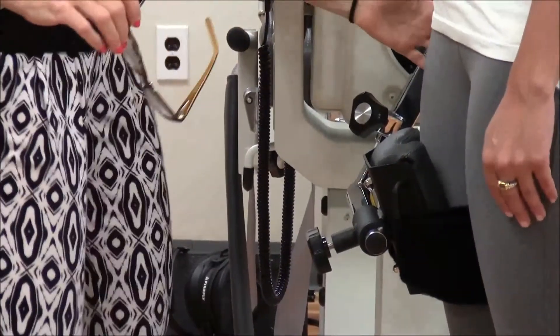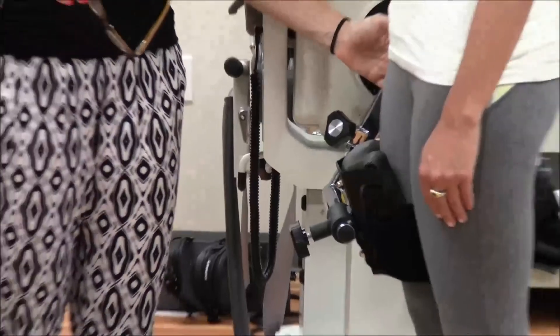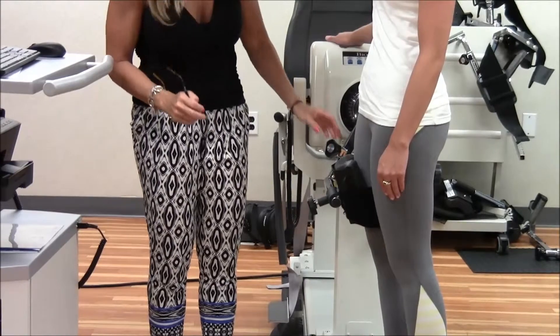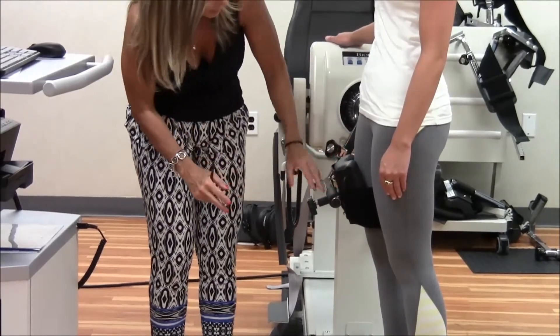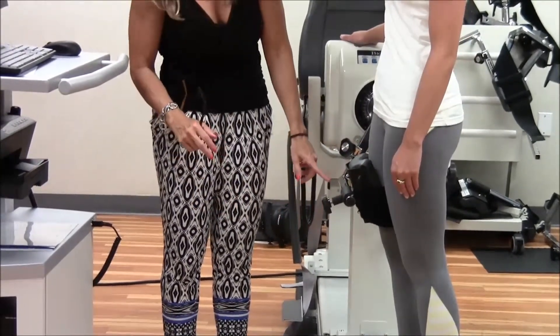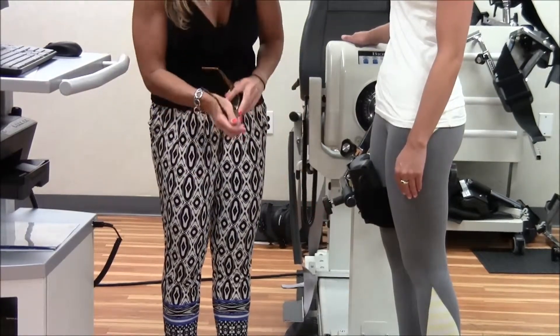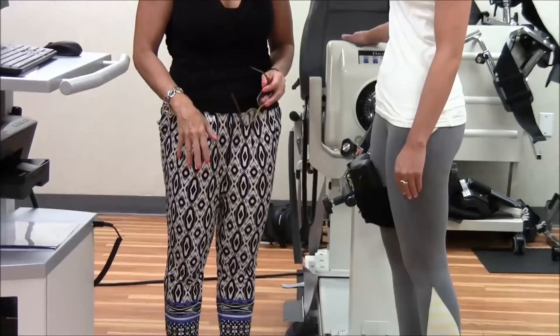We want to make sure that Megan's hip — her greater trochanter — is in line with the dynamometer. We want to make sure that the pad placement is about the distal one-third of the femur, and I have tightened the screw so we have taken out the wiggle from the pad.